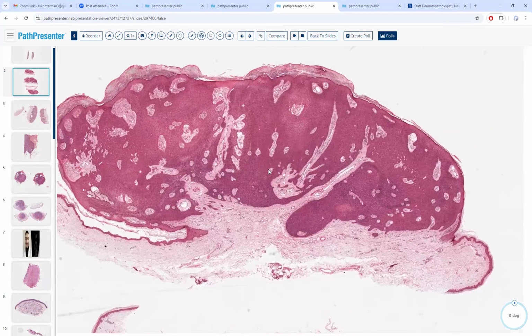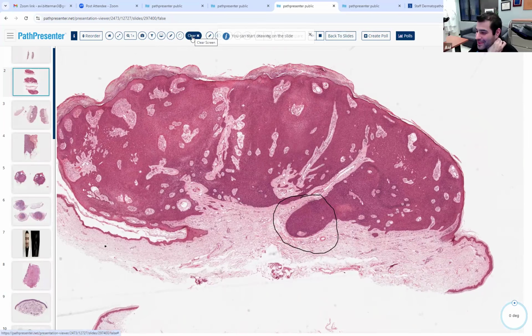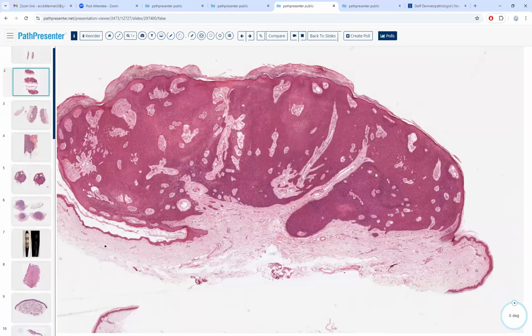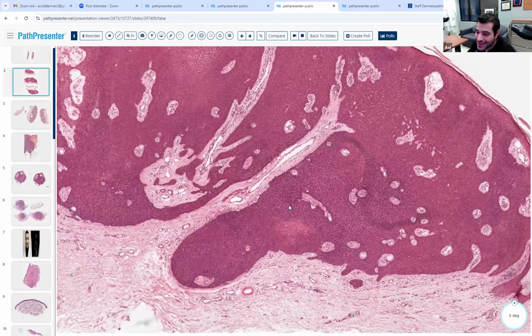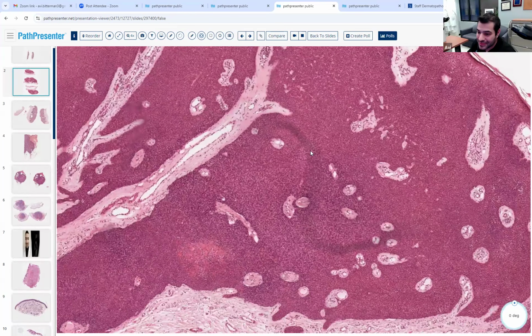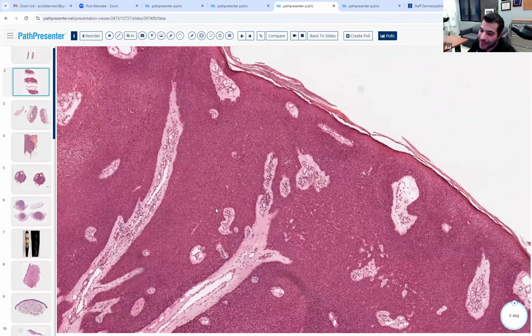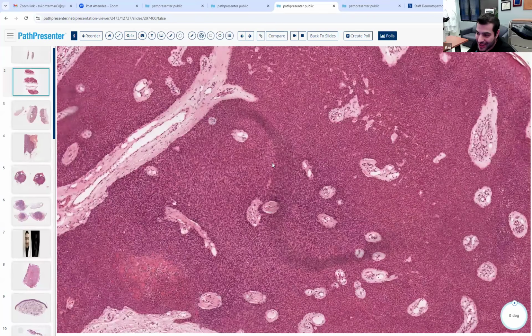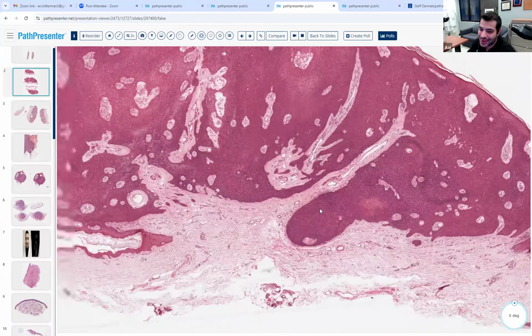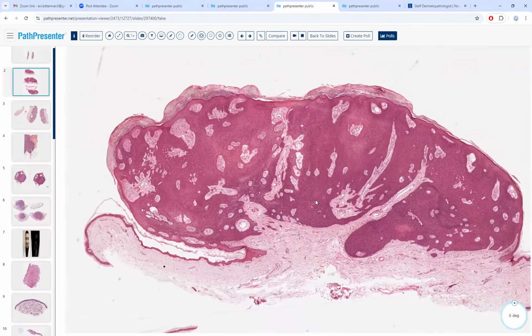That one looks, I don't know, like a mix. Is it only in the epi? It's dermal and intraepidermal. Yeah, it's epidermal and dermal, right? Otherwise the same. Monotonous cells. Some have described them as polyhedral. If you look hard enough, you'll see the ducts. Fibrovascular stroma. So what is this? Again, hydroacanthoma simplex.